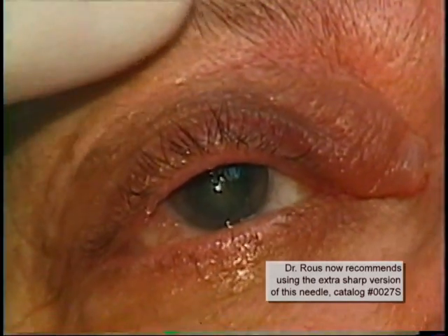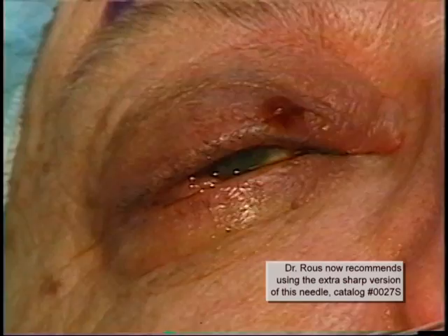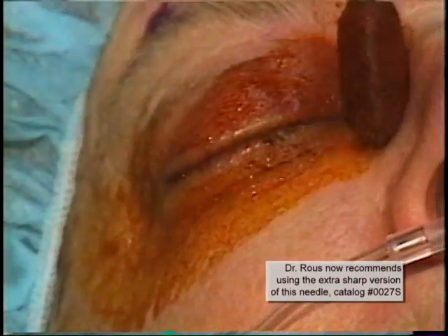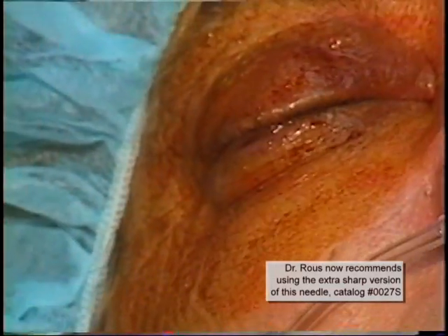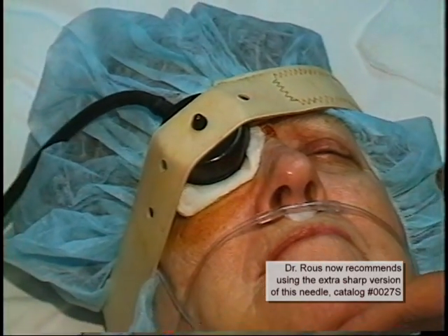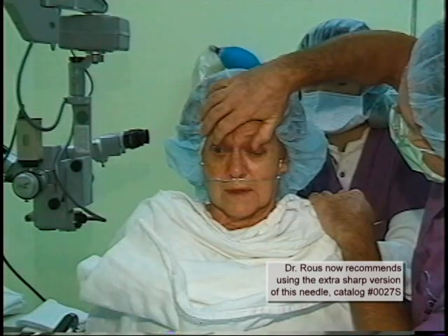After the speculum is removed, a couple of drops of betadine 5% solution are instilled onto the eye. The lids are swabbed with betadine 10% solution. A patch is placed over the eye and a Honan's balloon is placed over the patch. Approximately five to seven minutes after the injection sequence has been completed and the Honan's balloon placed, the patient is brought back to the operating room. Some additional digital massage is done for about five minutes to further decompress the orbit.